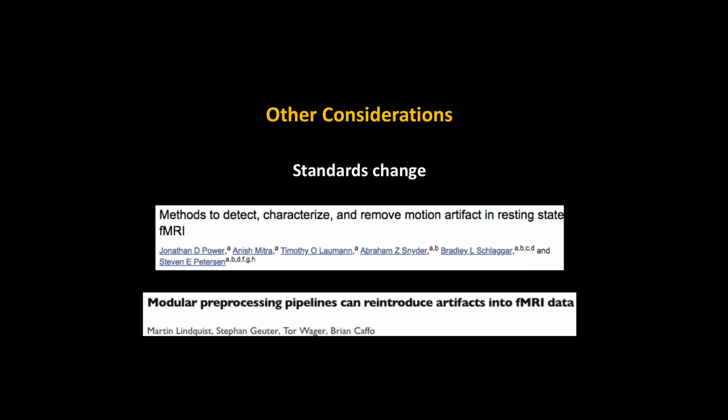The other one is a recent preprint that Cindy brought to my attention. Again, want to emphasize this has not been published yet, but I did give it a read through. It is pretty compelling, and I do think it probably will get published eventually. The Reader's Digest version of this is that we do all of these pre-processing steps, and it's kind of implied in the way that we do it that these things are orthogonal to each other, right?